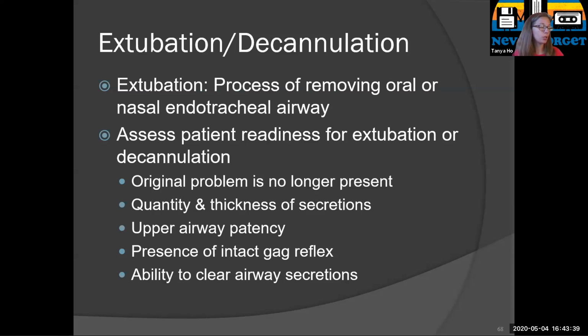Okay, extubation or decannulation is when you are intentionally removing the endotracheal tube. This is why we are trying to evaluate and do this as quickly as possible on every patient. We do not want to leave an endotracheal tube in place for anybody if they don't need it. You have to be able to pronounce and spell extubation, okay? Extubation is the process of removing the oral or nasal endotracheal tube. Decannulation is when you're removing a tracheostomy tube. But today I'm talking about extubation.